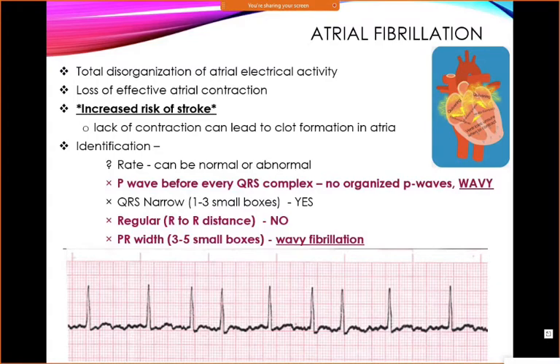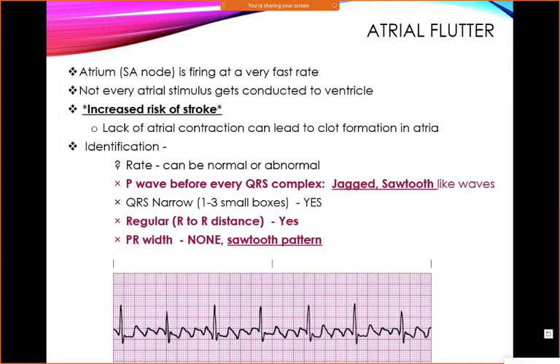And you're like, but I want to call that a P wave. None of them match. So let's say, oh, I really want to call that a P wave. I love that one. But there's no other one that matches it. You're like, maybe you're just trying to make a case for something that's not a P wave. A real P wave will be a nice hump like that. On this one, you have multiple P waves, and they're usually in a pattern.